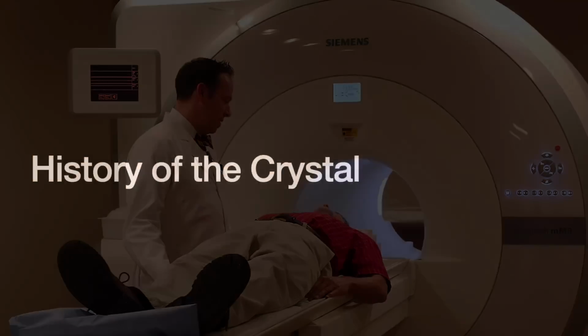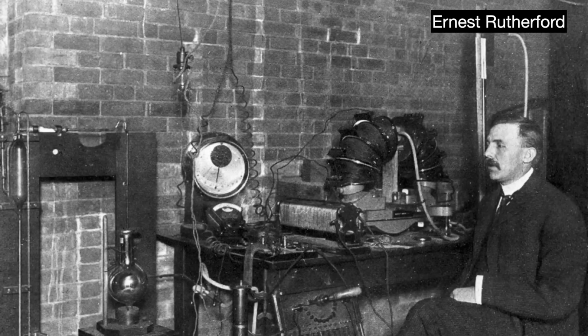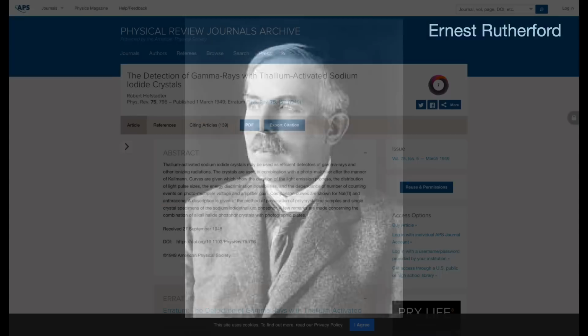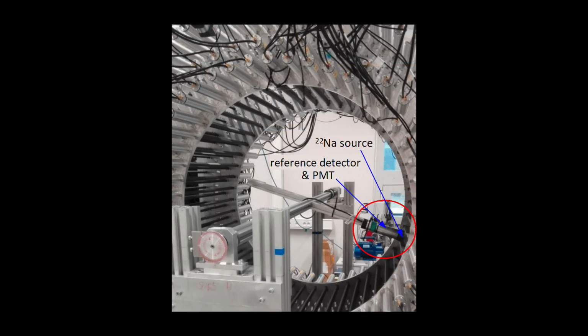The scintillating phenomenon was first discovered in an experiment involving water and radium back in 1903. 5 years later, the Kiwi physicist Ernest Rutherford used a screen made of zinc sulfide to observe the scattering of alpha particles. This was the first time anyone used scintillation to help observe atomic structures. Then, in 1949, physicists discovered the first high-performing scintillator crystal, the thallium-doped, or thallium-activated, sodium iodide crystals. Over the next 35 years, that thallium-doped sodium iodide crystal would be the historical standard. Early PET scanners used this crystal throughout the product's development.